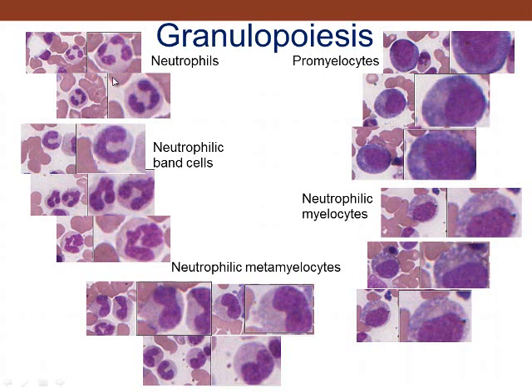So if you start with what you know and back up, look at how the nucleus is changing, and then how the cytoplasm is changing. Remember that the more immature cytoplasm is going to be bluish because it has to make something. It has to have the machinery, which is the ribosome, to do something. Also, in the immature cell, you have a more euchromatic nucleus because it doesn't know if it's going to be a fireman or a dentist or a doctor or a policeman yet.